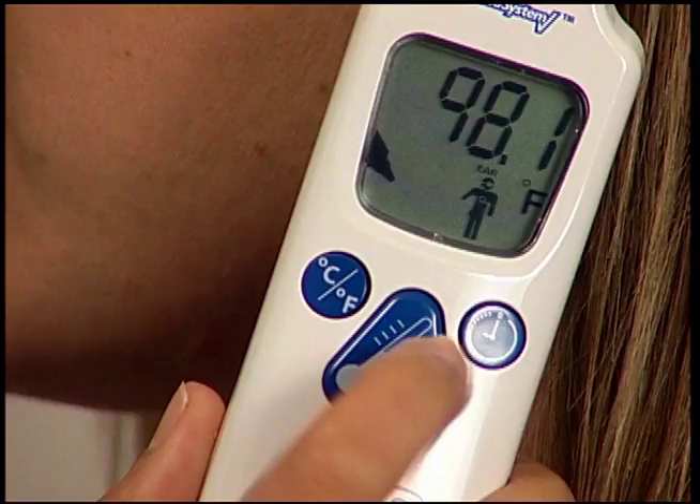If you do not hear a triple beep, a temperature was not taken. Check the display for any error messages and check to ensure a probe cover is attached and loaded properly.